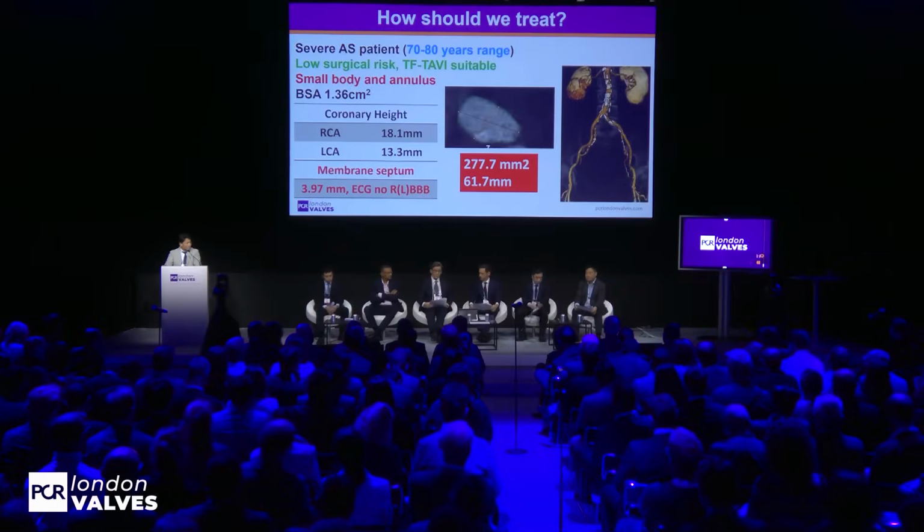The other thing I would consider is, if it's a supra-annular valve, I worry about sinus sequestration because of the small STJ and also future coronary access. So probably I would choose to balance good hemodynamics without jeopardizing the overall anatomy, because not just the annulus, but the STJ and sinuses are all very small. That is also important to consider for lifetime management of this kind of patient.